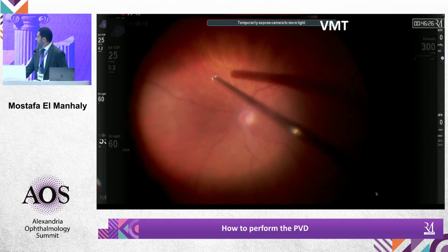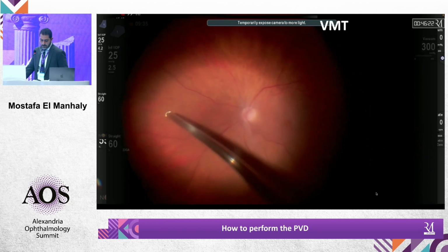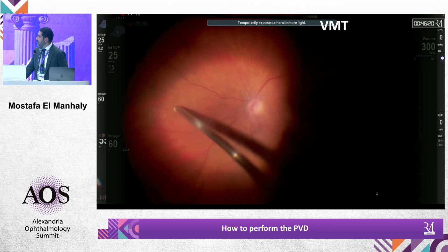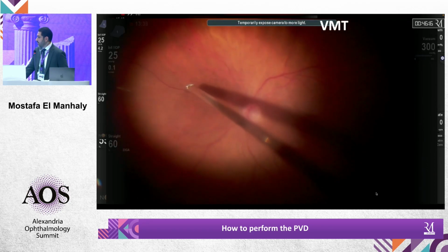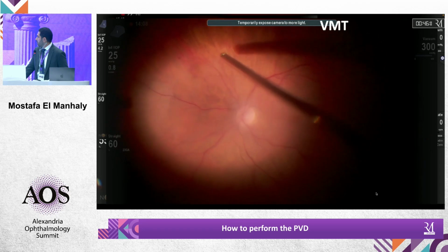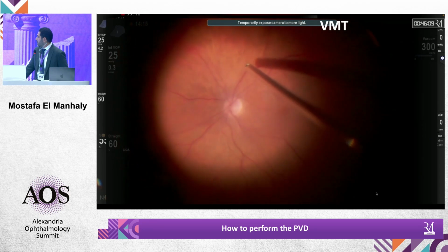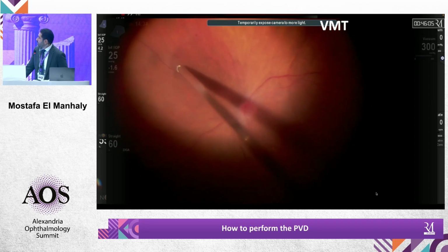This is not true. Usually there is a sheet of posterior hyaloid on the retina in those cases. Maximizing suction, changing the site of starting the induction of PVD, and maybe scraping with triamcinolone staining, so maybe hydrodissection.